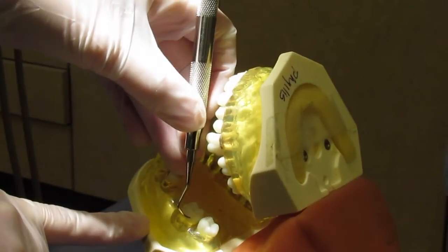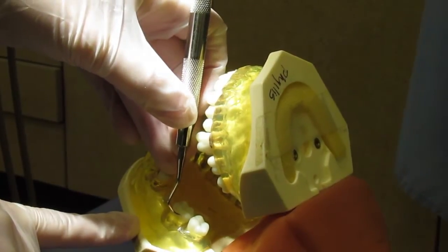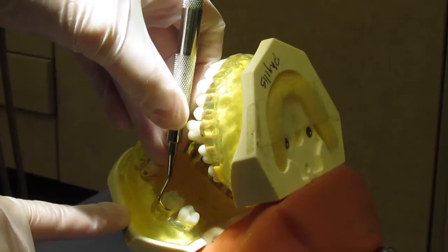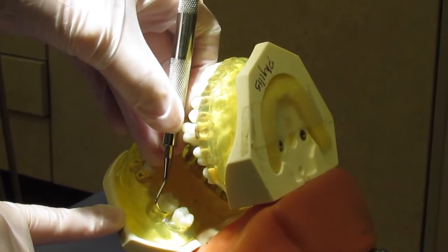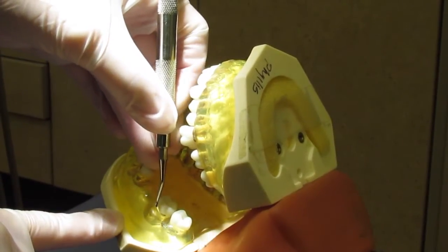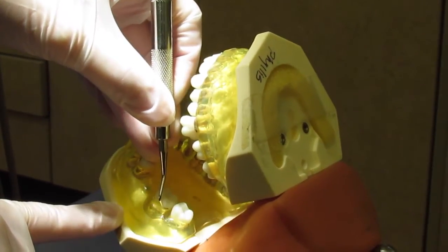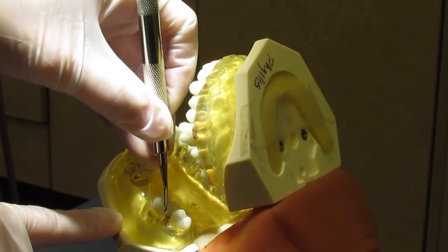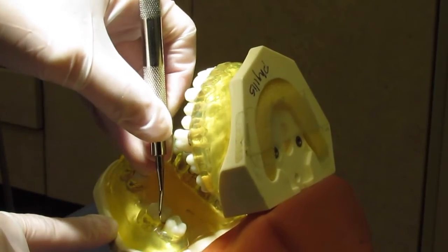This is the universal curette. We're going to be using it on the buccal of number 18. First, we'll start off at the distal line angle. We will activate the secondary blade, starting at the distal line angle, and then insert subgingivally, closing the blade, and then start activating overlapping strokes, rolling and pivoting to get into the distal, and then up and down strokes until you're halfway.